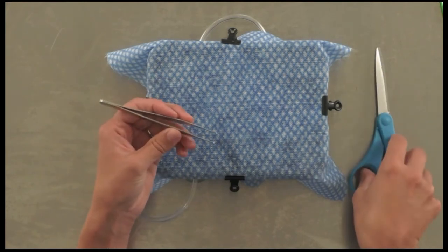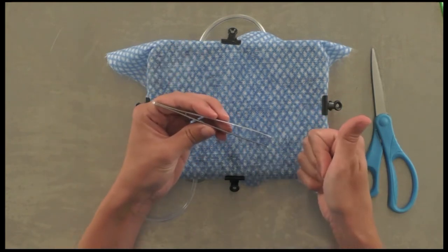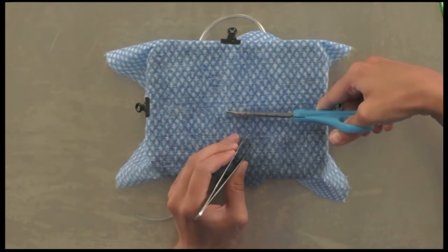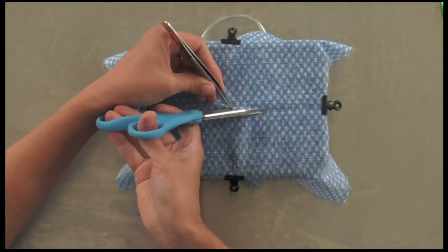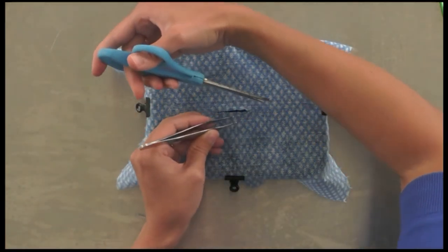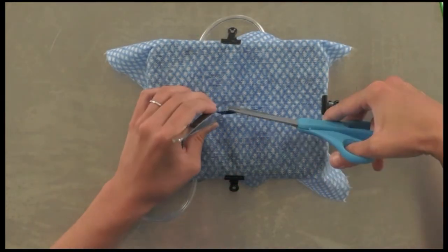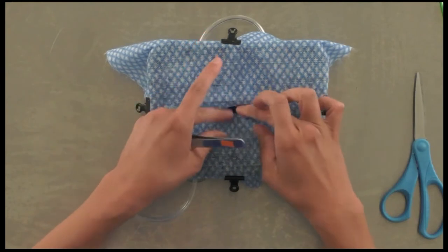When you're ready to spay your model, grab your thumb forceps — remember to hold them in the correct way. Use a pair of scissors to tent up the fabric, make a little snip big enough to get a blade of your scissor in, then cut cranially and caudally. If your scissors aren't super sharp, switch to the backhand technique. Use the thumb and ring finger grip — fourth finger — when using your scissors.